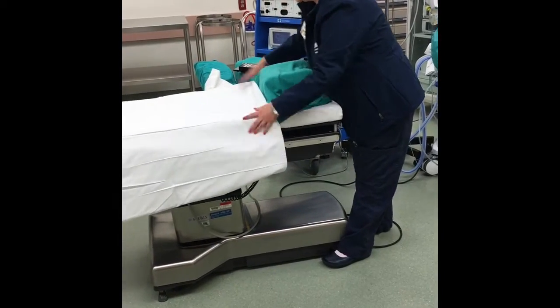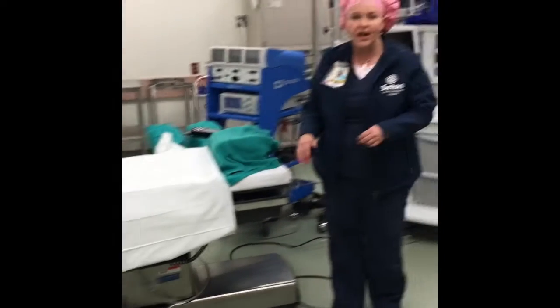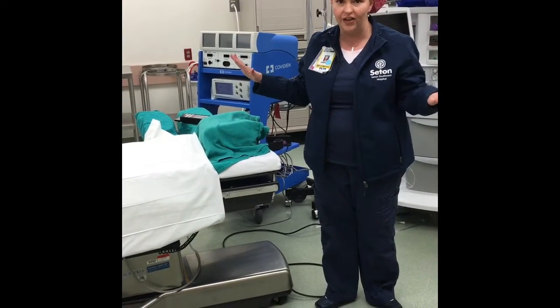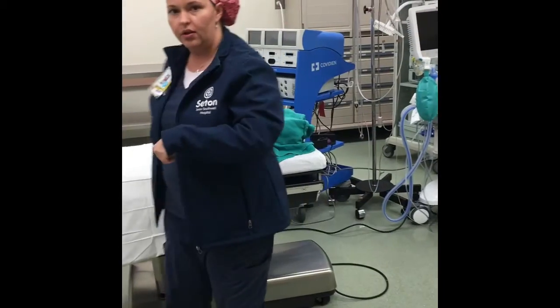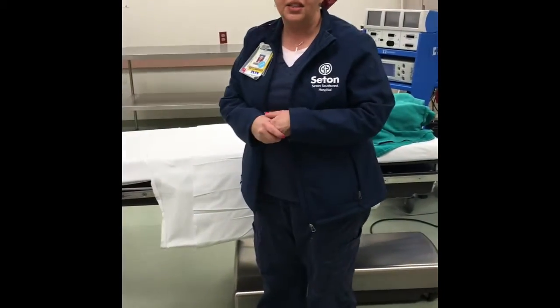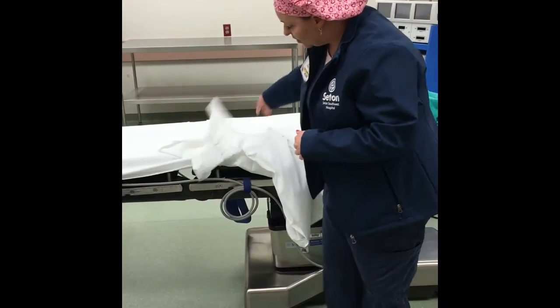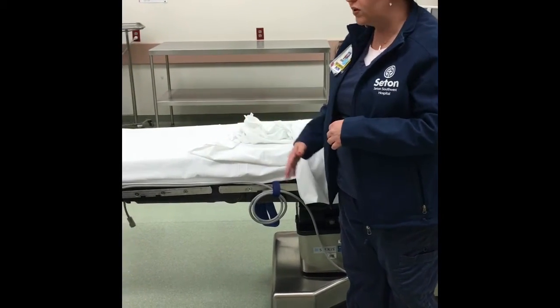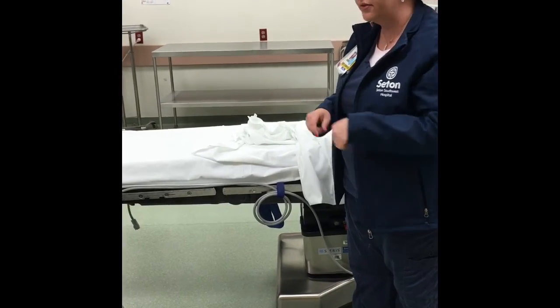And Nicole, why are we doing this piece? So we never want any rippled sheets underneath a patient. We always want it to be flat and smooth. And why did we pull the head of the bed down to the foot of the bed? We did that so that we're gonna put the stirrups on the bed and we're gonna be dropping that foot down. So we'll want all of those pieces to come off.